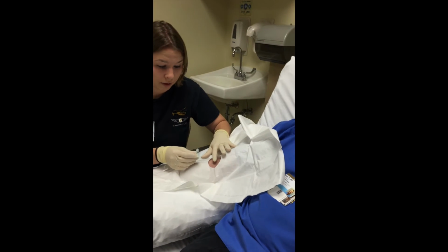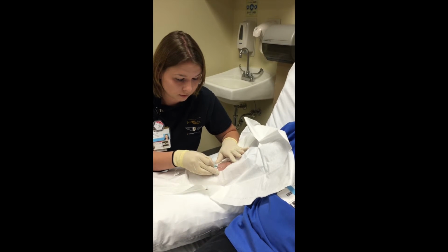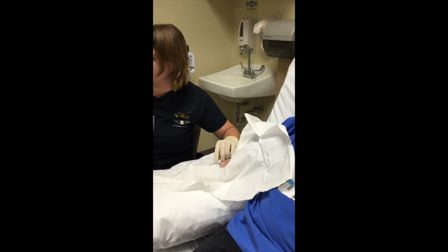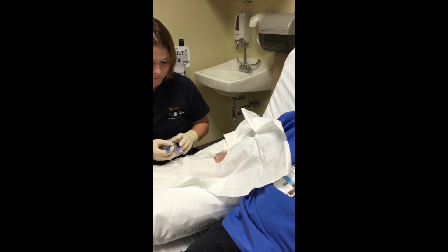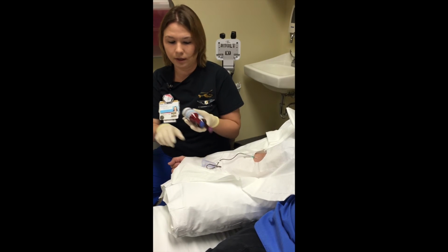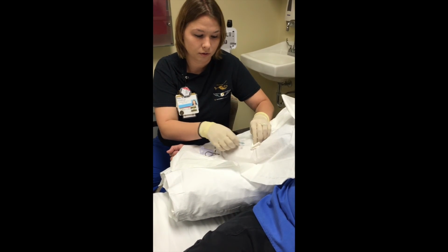So now, like I said, you could repalpate your vein if you can't decide where it is. And then you're going to stick. One, two, three, big stick. Once you get a flash, as seen there, you're going to take the alcohol prep pads off of your bottles and obtain your samples. You want to get about 8 to 10 mils in each of the sample tubes. And then you want to lightly shake them and set them down. And you're all done. So you will pull out the needle as you normally do.